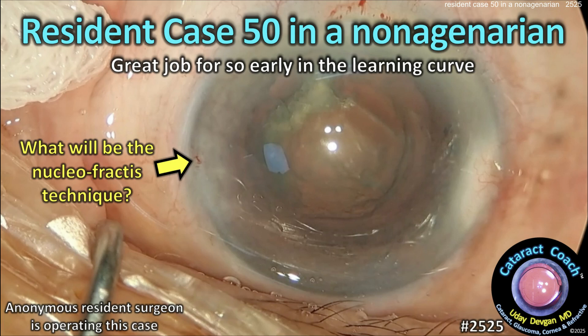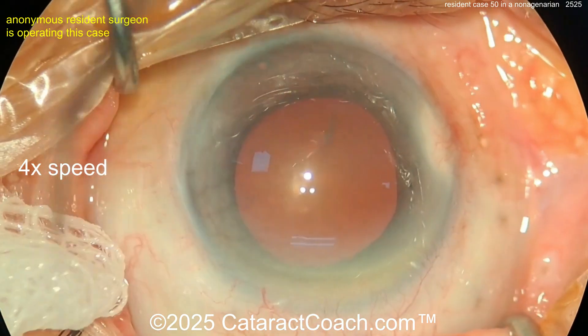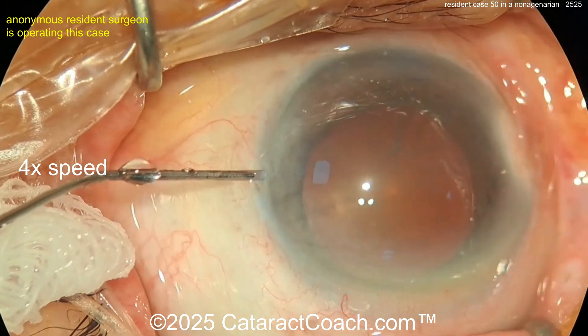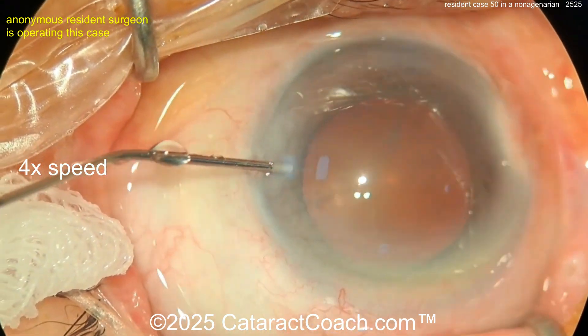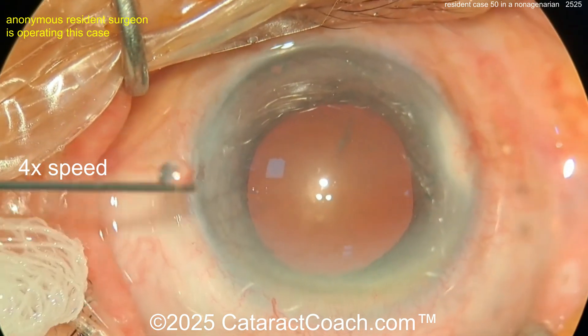This is cataractcoach.com resident case number 50 in a nonagenarian — great job for so early in the learning curve. A nonagenarian is a patient in their 90s, so an older patient with weaker tissues. There are many videos on Cataract Coach explaining how nonagenarians' tissues are different and a lot weaker.